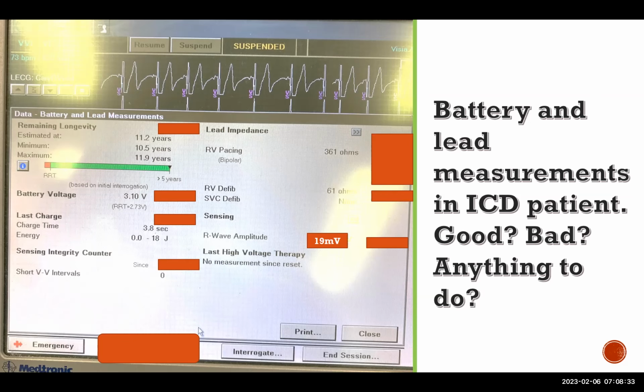Let's say you're in the cath lab and you're putting a lead in, and the representative of the company who's standing by the PSA says the R wave is X. What number would not be an acceptable one? So maybe less than 10. Actually, less than 4. Less than 4. 4 is like sort of generally.